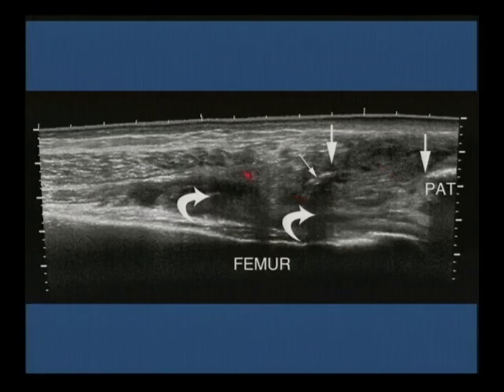And then here's the same patient from that X-ray. Here's the superior pole of the patella. So this is a longitudinal extended field of view. And notice the appearance looks nothing like the appearance we saw with the normal quadriceps tendon. So there's a tear. The tendon has torn at the superior pole of the patella. There's a big gap here. There's a hemarthrosis. There's actually fluid tracking anteriorly.